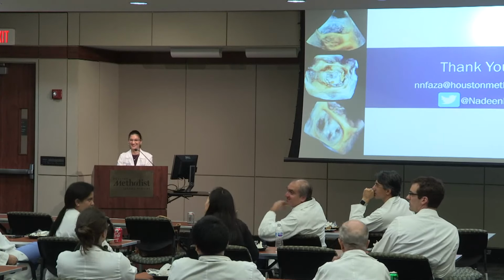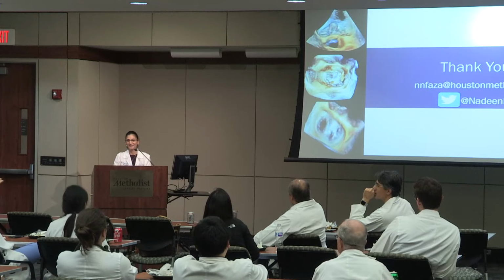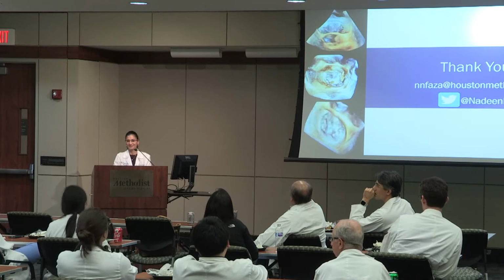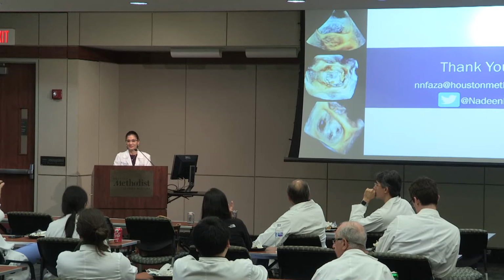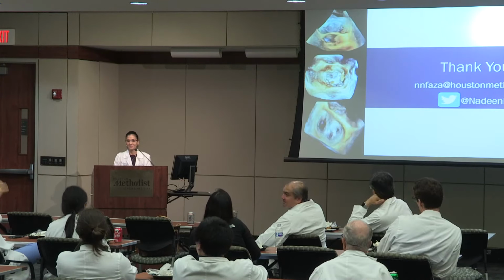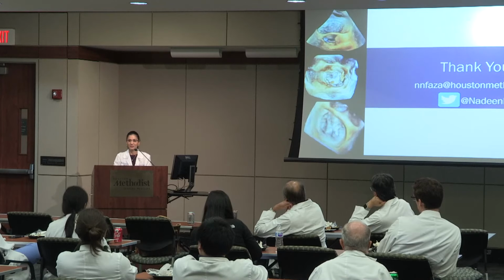Perfect. Okay. So, first of all, wonderful lecture. Thank you. I know this takes time to prepare. Two practical questions. One is when you guys are there in the middle of the case, are you using more real-time 3D or are you still using the biplane where you put the area of interest and zoom to 3D? Which of the two are you more likely to use during these procedures?